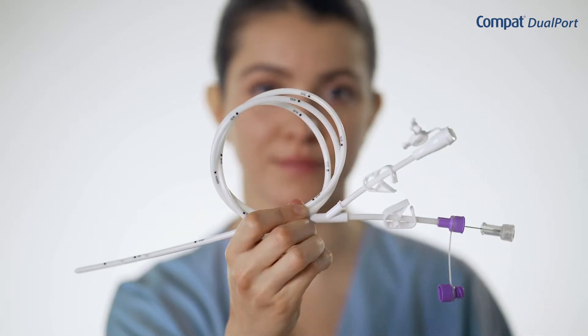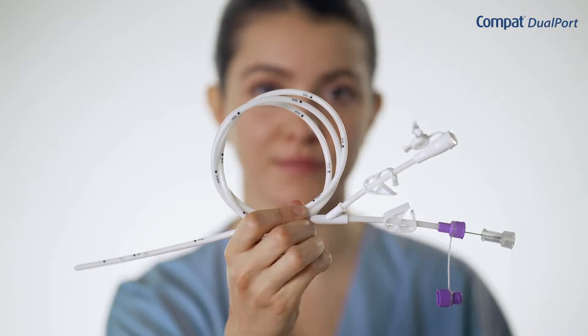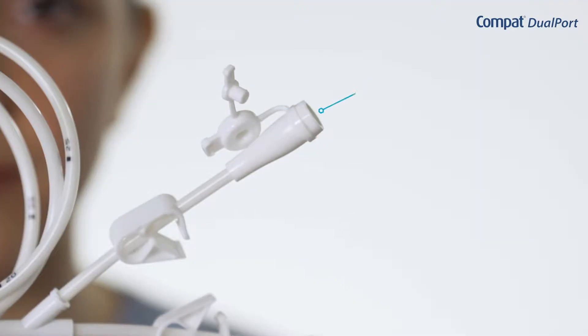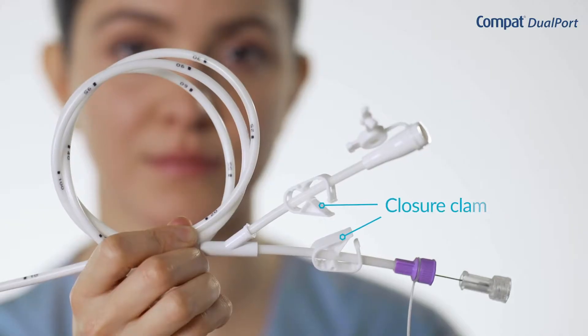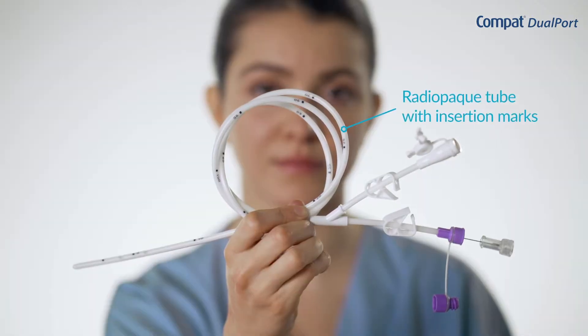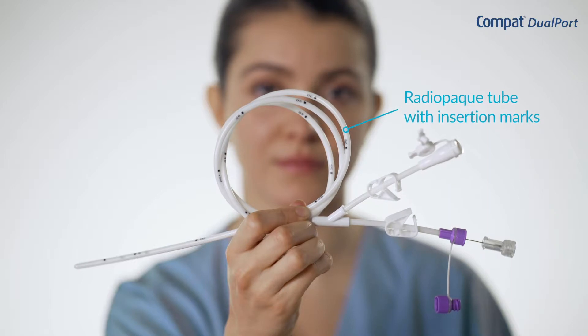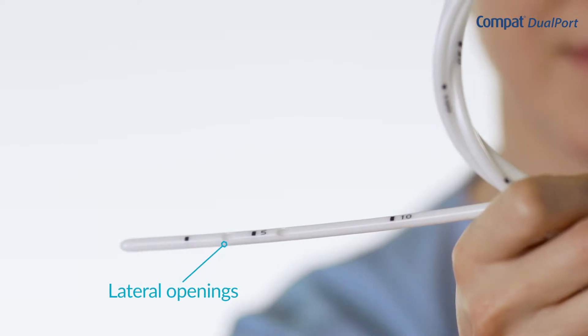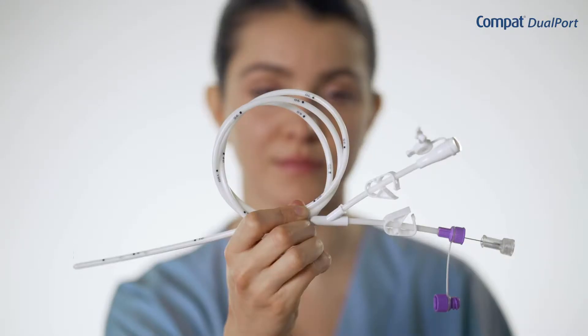The Compact Dualport tube is 120 cm, 14 French. It consists of seven parts: a stylet to facilitate tube insertion, an Enfit connector specifically designed for enteral feeding, a funnel connector compatible with most drainage devices, two clamps to facilitate gastric drainage and aspiration, a soft fully radiopaque polyurethane tube with insertion marks to confirm proper position, four lateral alternate openings to ease the flow of fluids and prevent the risk of tube obstruction, and a rounded distal end for non-traumatic tube insertion.